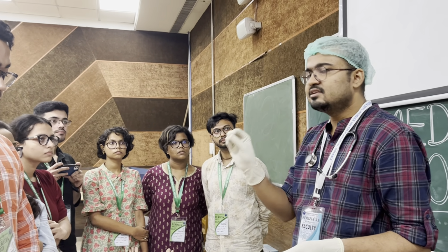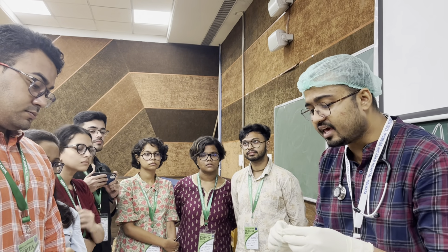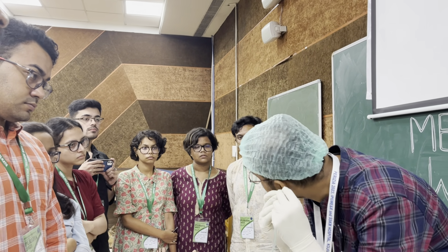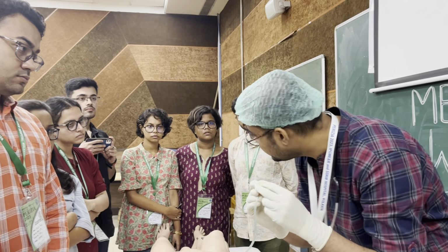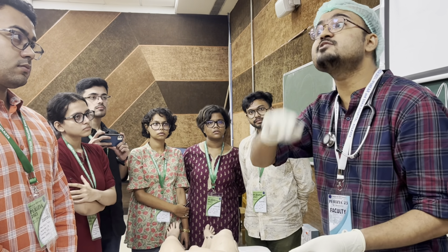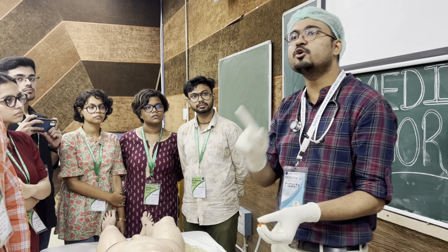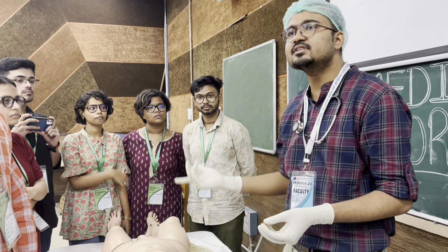If something is entering into the respiratory tract, there will be a cough reflex, a vigorous cough reflex, and you can hear some hissing sound. If you place it near your ear, you can hear a hissing sound, meaning to and fro respiratory sound, inspiration, expiration. That means it is in the wrong place. Number one, right place. How to confirm?